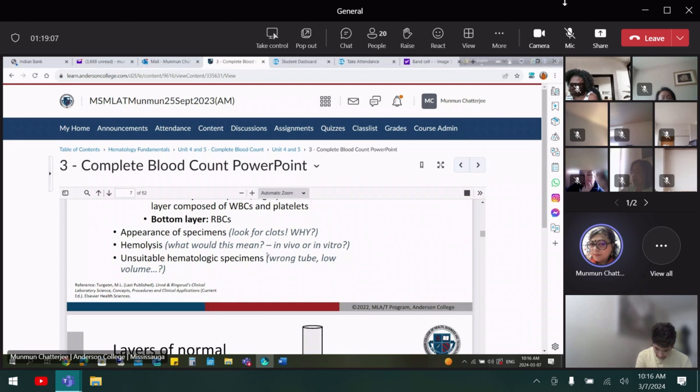Here you don't have the specific label in the lab, you are writing and putting it. But when there is a CBC label, you have to put the CBC label on the CBC tube. When there is a mint tube or electrolytes, you have to put the specific labels. Otherwise, wrong tube, wrong label, cancel.